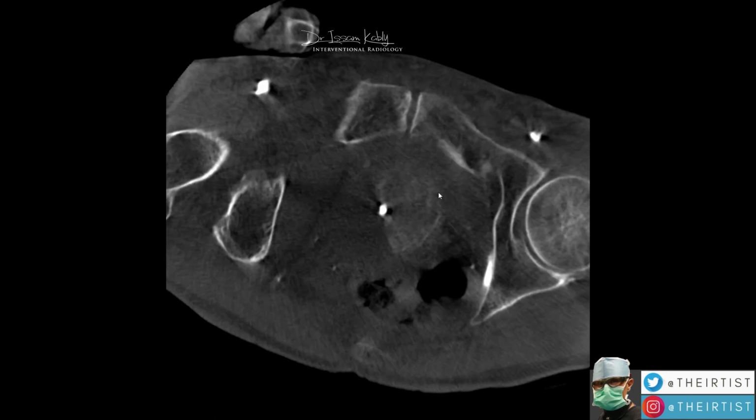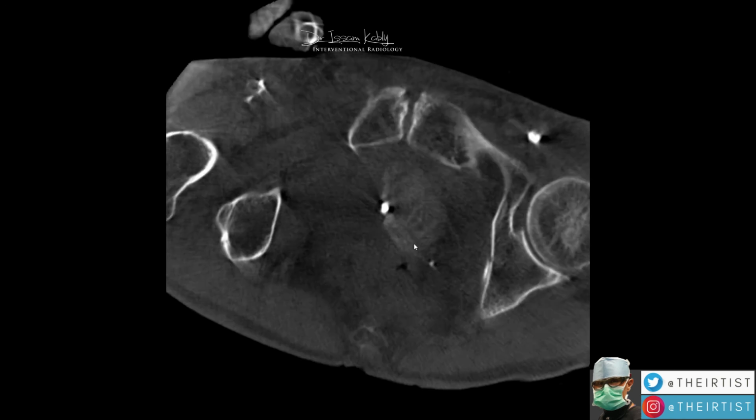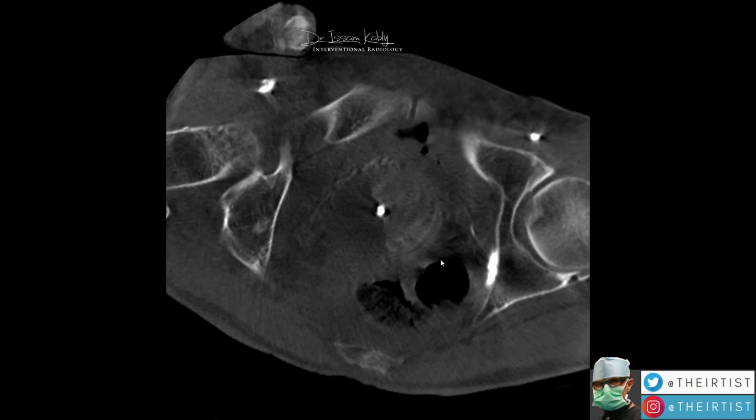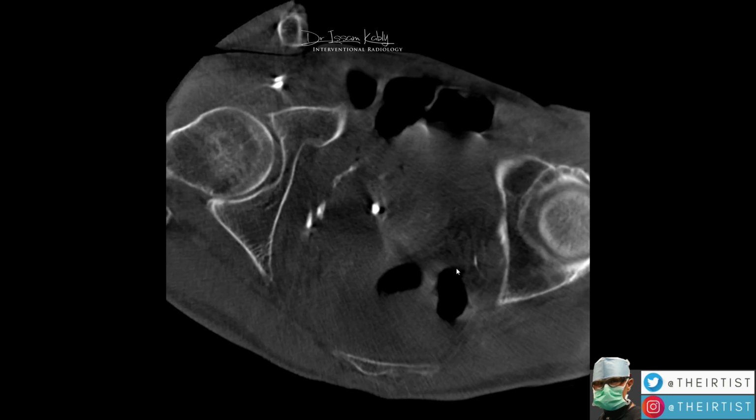Here we are looking at an axial view, meaning we are slicing the prostate and looking at it from the top. As you can see here, one lobe of the prostate, and this is the Foley catheter in the middle. We injected the particles and we did the other side. It was actually more difficult. I'm just going to skip it for now.